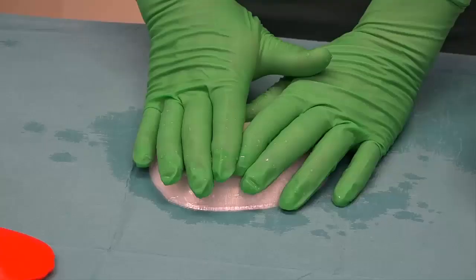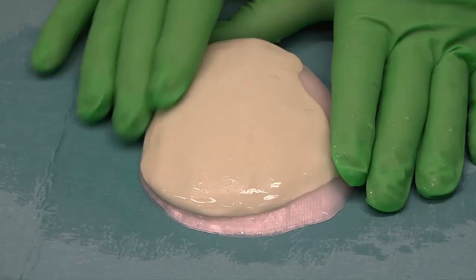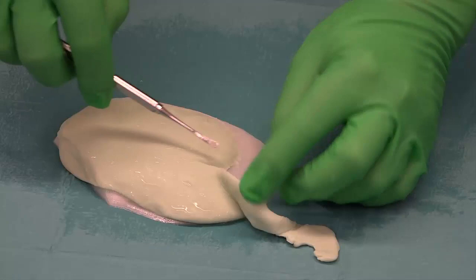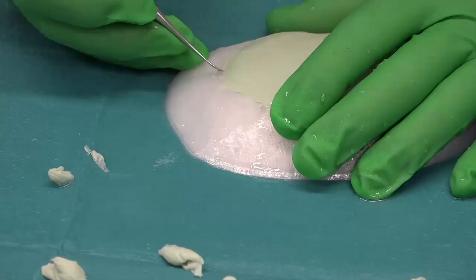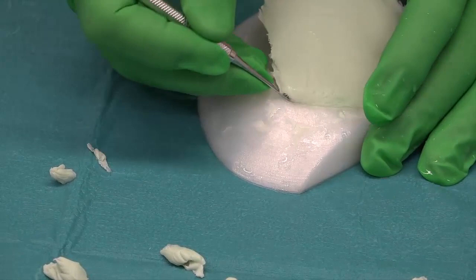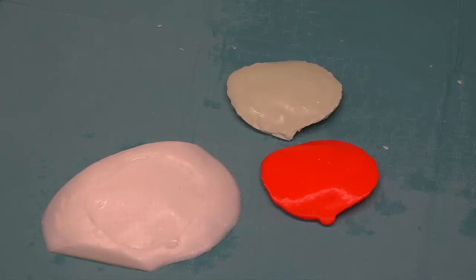So Peter has made a small cake here, and he makes the surface smooth, and with a dissector he cuts the redundant material. In the beginning, we were a bit afraid that the acrylate plastic would fasten in the mold. Here you can see that it's not really hardened, and that is a process that takes about 15 minutes or so. But this looks like a very nice implant. It's now Peter Siesjö, the neurosurgeon again, and we will present the case.